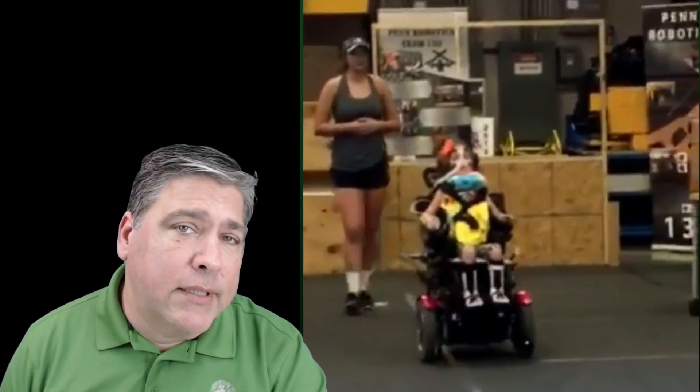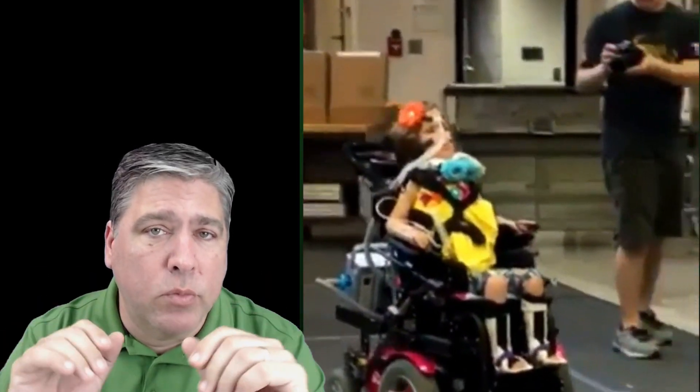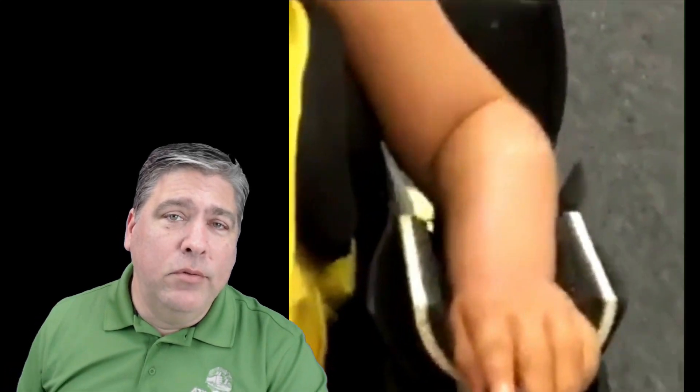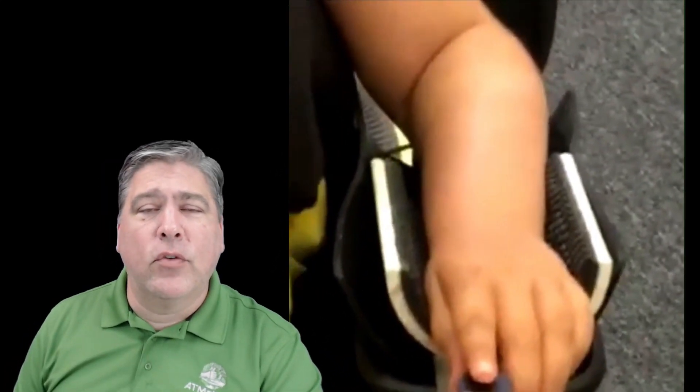Ella has Spinal Muscular Atrophy, or SMA, which is a degenerative muscle disorder. When we met her, she could move just two switches, one on each hand. So we created a device that let her drive her power chair with just those two pieces of input. As you can see in the video, she did great with those — she rocked. The kids from Penn helped her and gave her a space to practice.